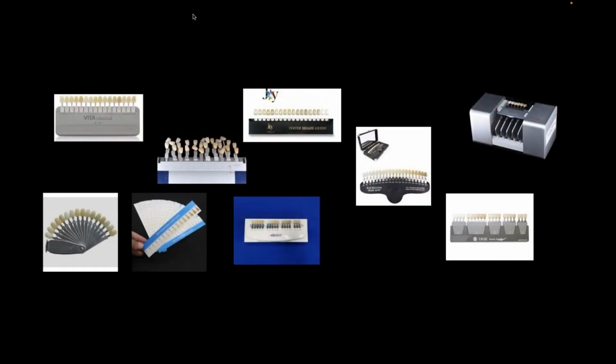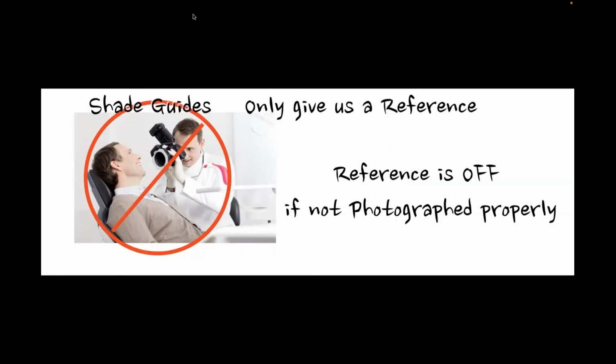And let's be clear, there's a lot of shade guides out there to use. I tend to work more with one, the Linear 3D guide, and I'll break that one down for you. But all of them are really just references. So what I try to do in the shade taking system is come up with a way that simplifies what I do, how my doctors work with it, and how we can utilize that system every day easily.